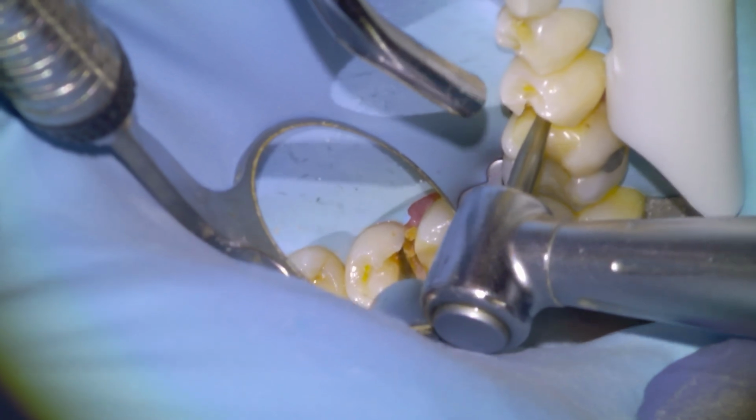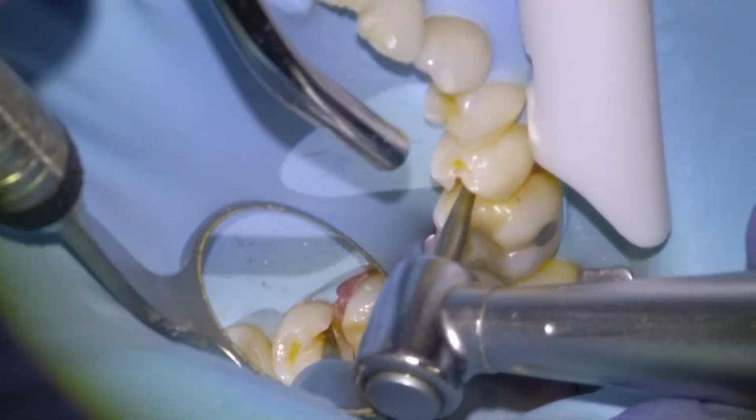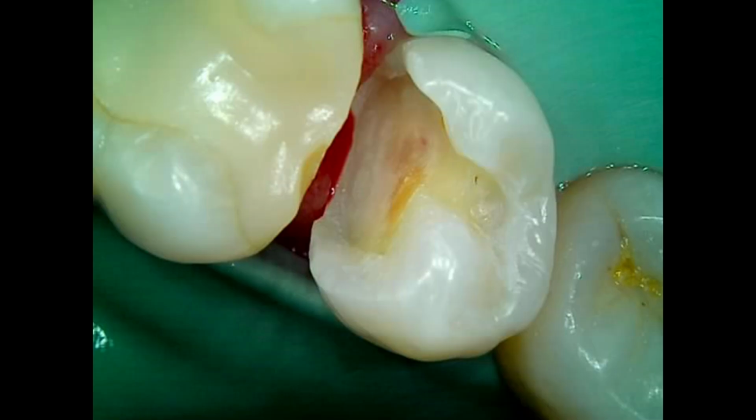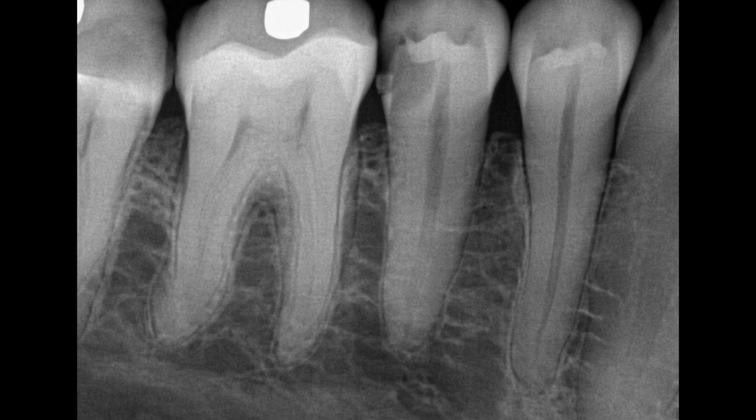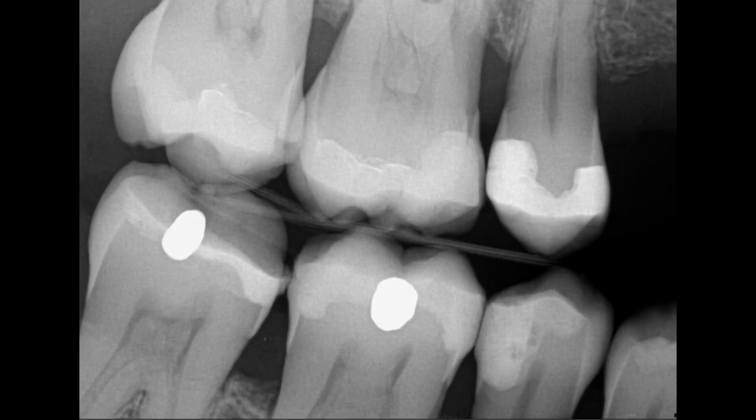Hey guys, Dr. Dobson, and this one's going to be a very deep class 2 restoration. This is a patient that complained of hypersensitivity to cold in the lower right, and you can see the cavity on the second premolar. Tested normal to pulp testing, no lesion on the x-ray. There's the final result, so we're going to get into the clinical footage here.